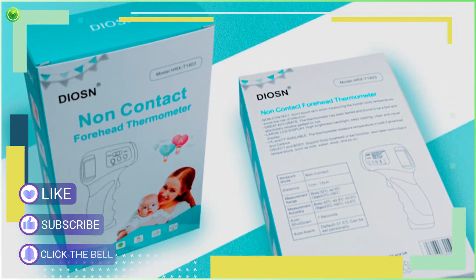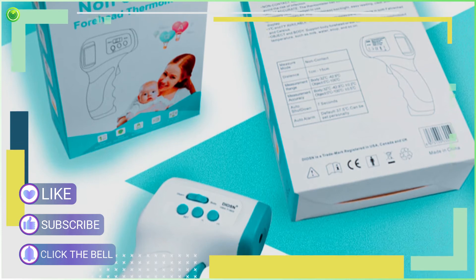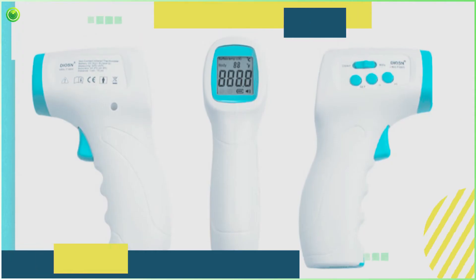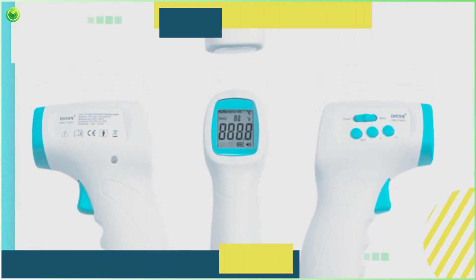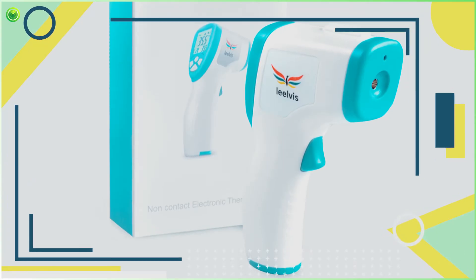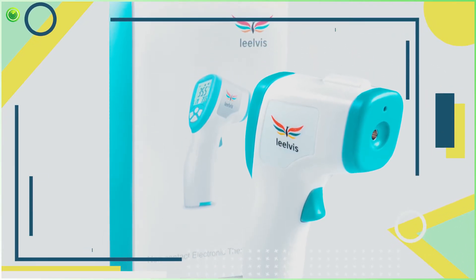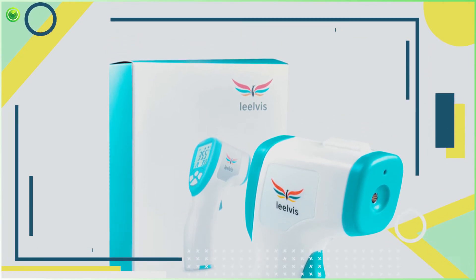Keep you safe from infected people: To measure temperature, there are lots of thermometers available in the market, but none of them are capable of measuring the temperature of a person without touching his or her body. Fast and Accurate: This device is impressively fast and accurate compared to other thermometers. You don't have to wait 10 to 12 minutes like with other thermometers, and the accuracy level is greater than any other regular thermometer.